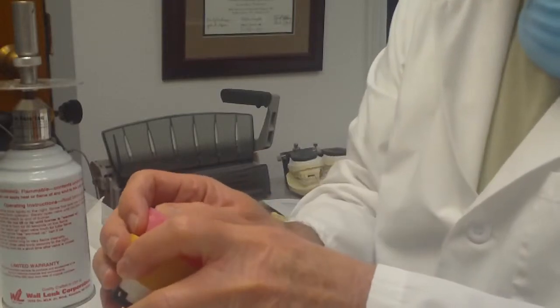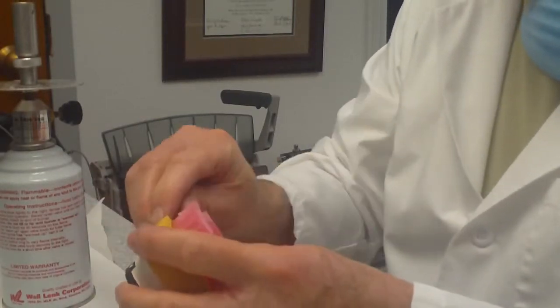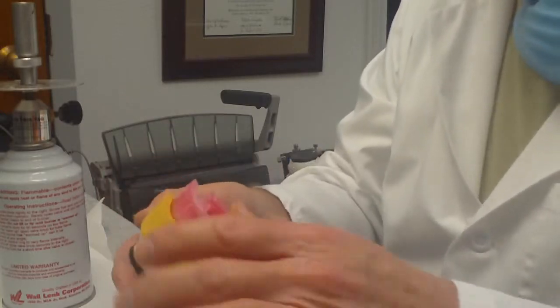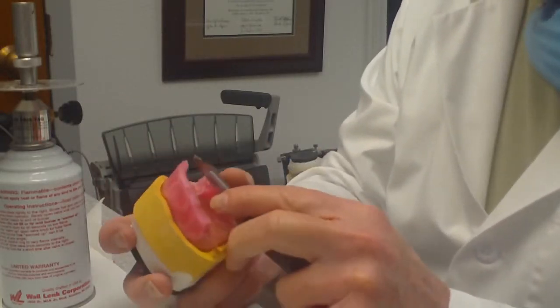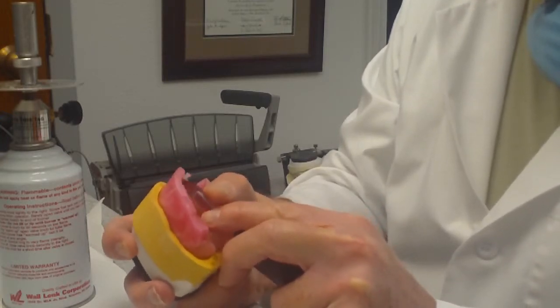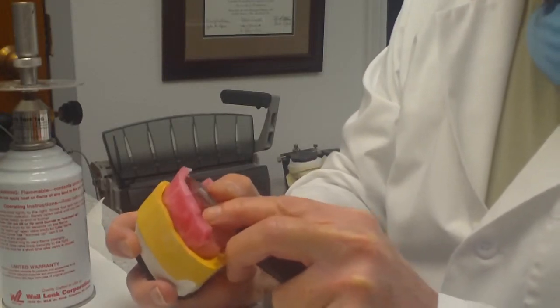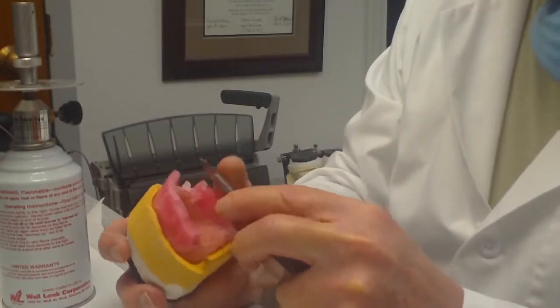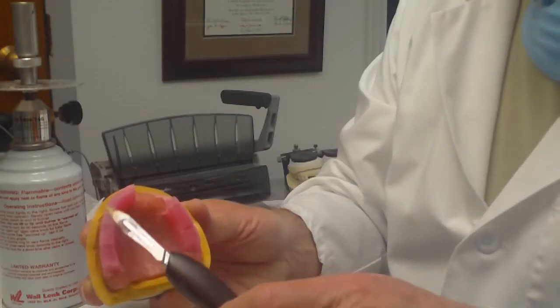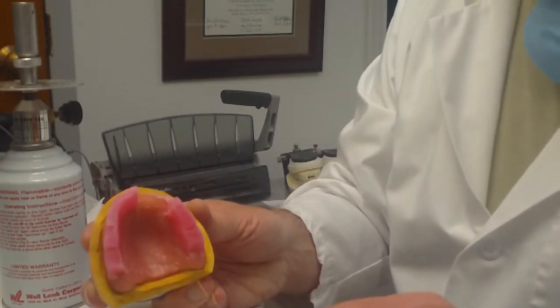Just taking a big piece out of this, and I know you might say, oh, I've lost all my guides, but I really haven't, because I know where the incisal edge of the tooth is supposed to sit, because I've retained my markings on the cast, and again I'm using the form of the opposite side to help guide my positioning of the teeth.